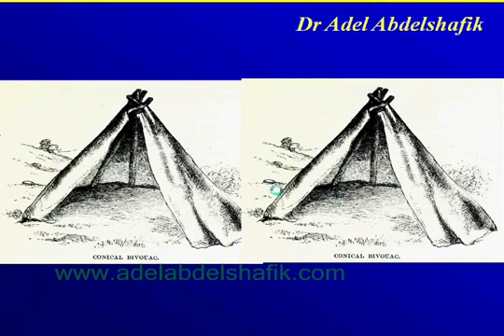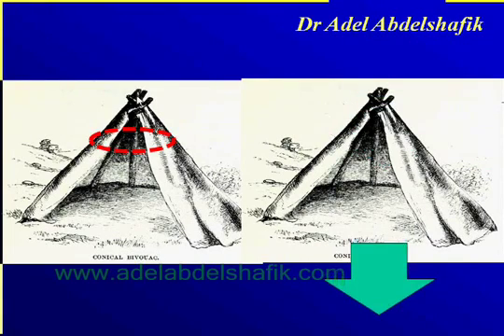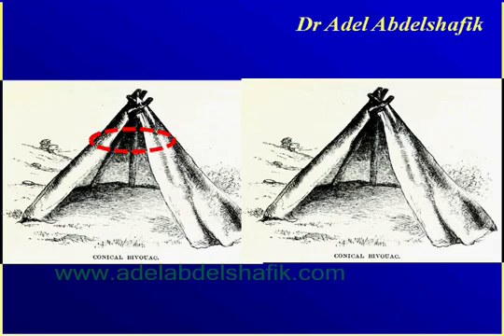If this is the retina and this is the attachment of the retina to the optic nerve, transverse section, you will end like this, while axial section, you will have that appearance. So this is the same tent. It means you cut it transversely, it will appear as an oval or circle, or you cut it axial or longitudinal, it will appear as a funnel.